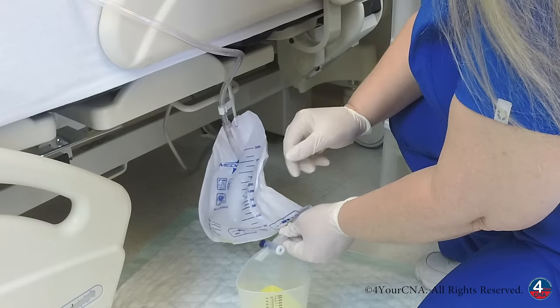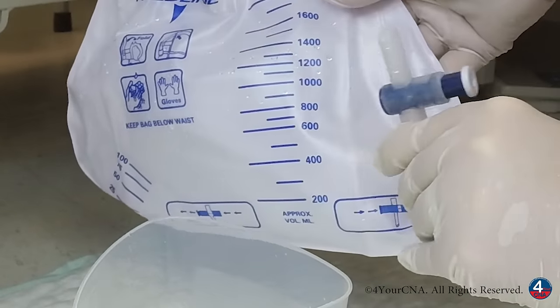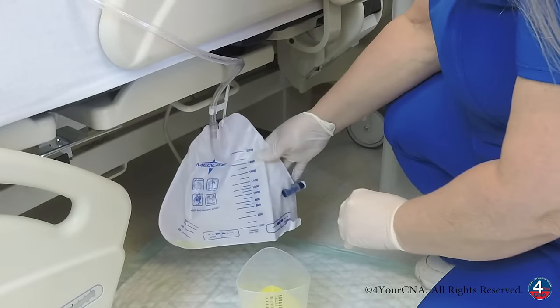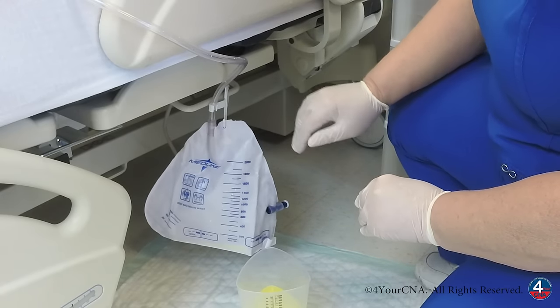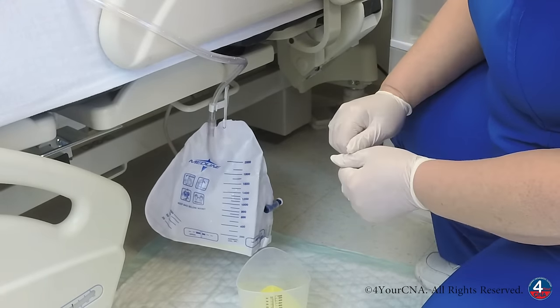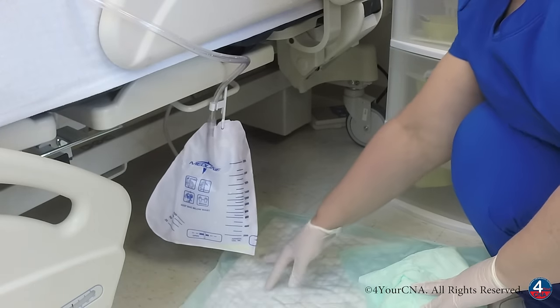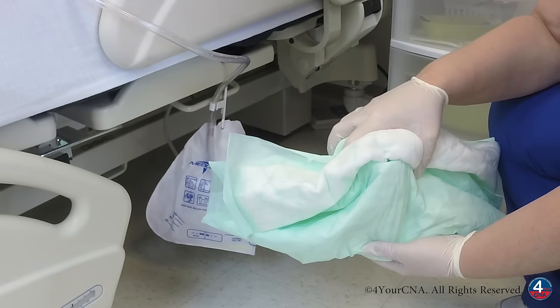Once the urine bag has been emptied, we'll slide the port back to the side to close it and very carefully insert it back into its protective sleeve. We want to make sure that the bag is hanging on a non-movable part of the bed and it's not touching the floor.